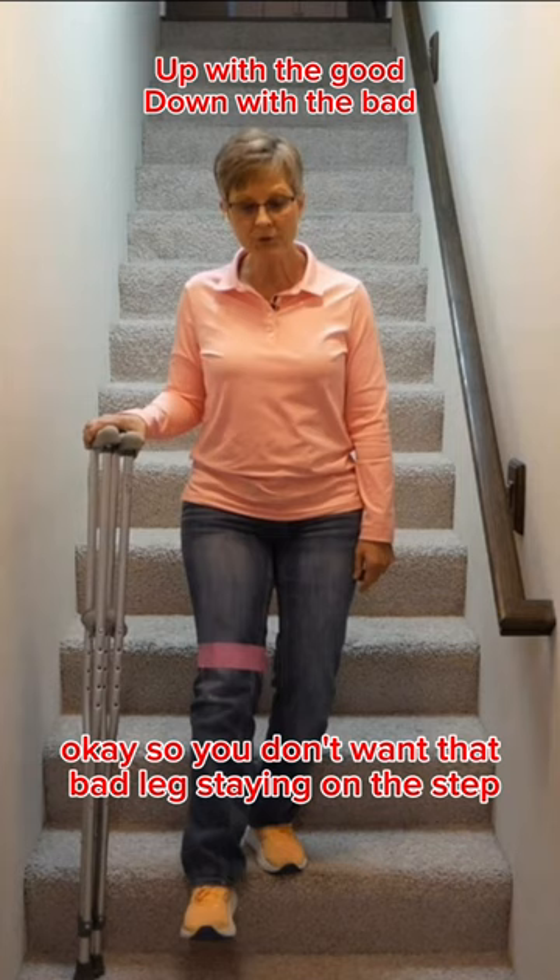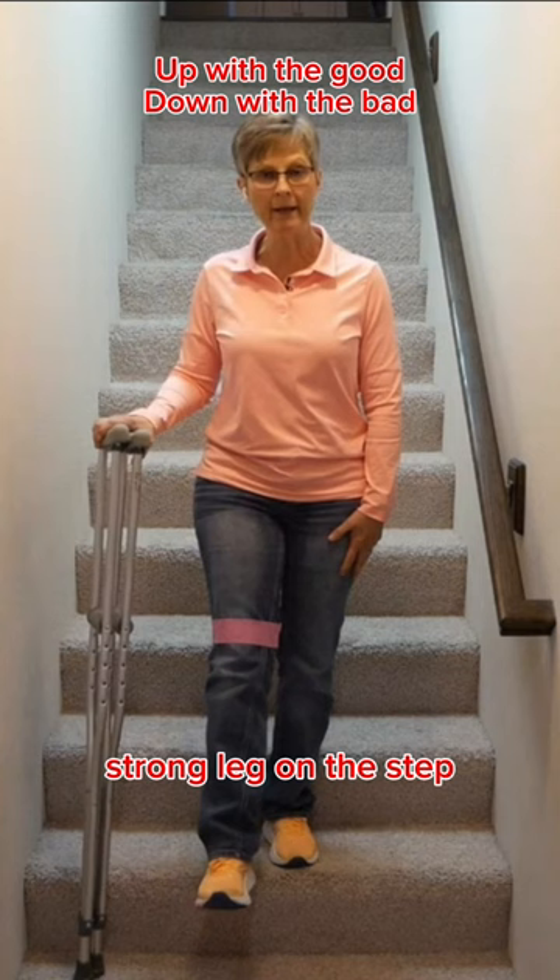You don't want that bad leg staying on the step and having to lower you down. You want the good, strong leg on the step. That's why the bad leg goes down first.